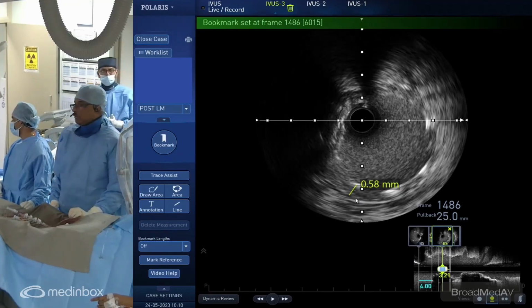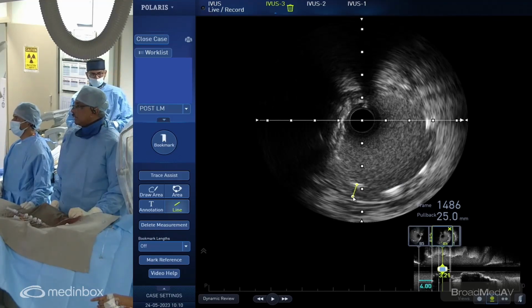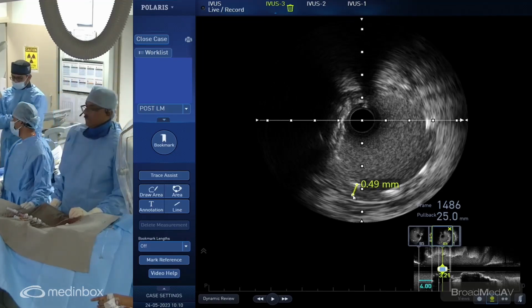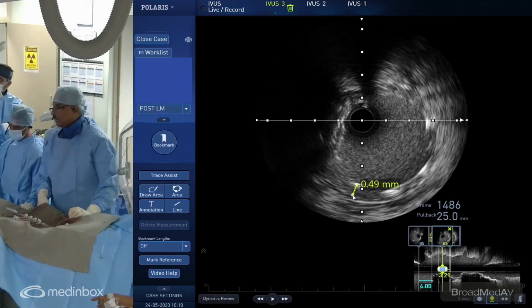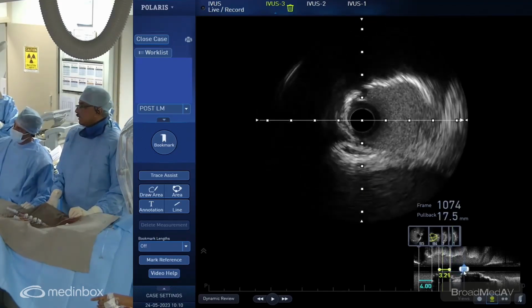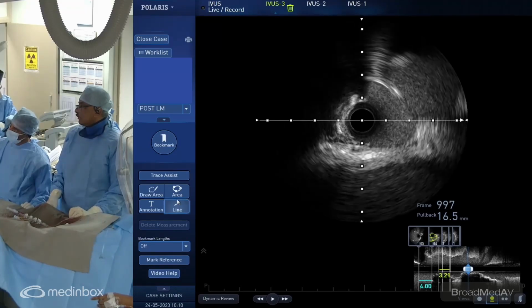What are we getting? 5 NC Quantum? Okay, that's fine. You need to be very careful as you go in that we don't distort any part of the stent. That's the key here. Even if we are coming out into the left main, no problem, but we should not go at the distal edge. At least we have to be 3 millimeter away from the distal edge. Can I know how far away are we from the bifurcation, the stent? Is it a millimeter or more?